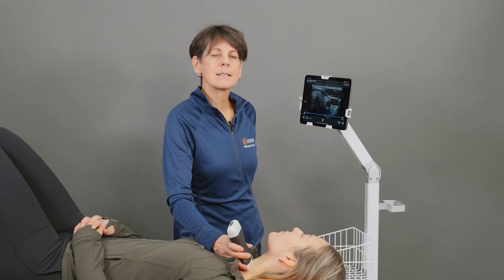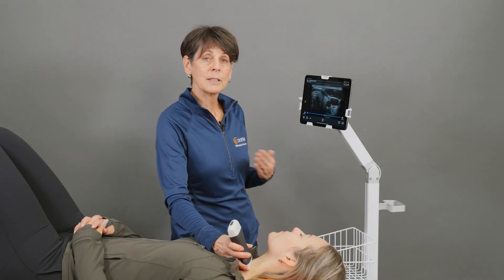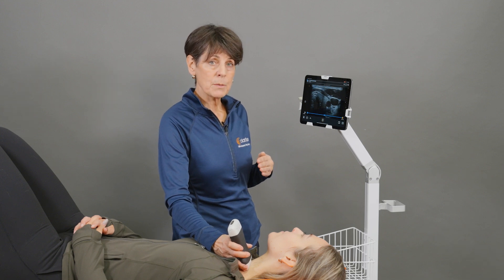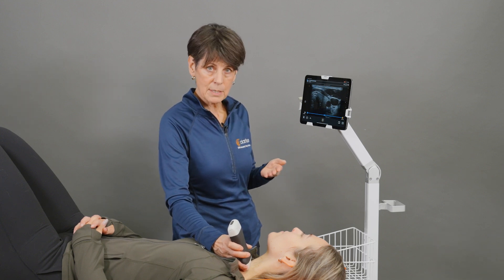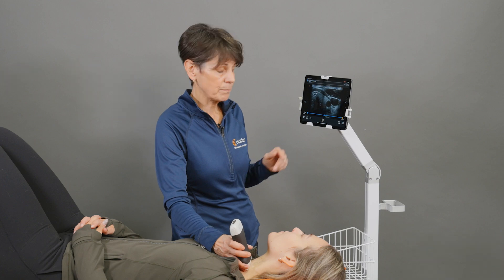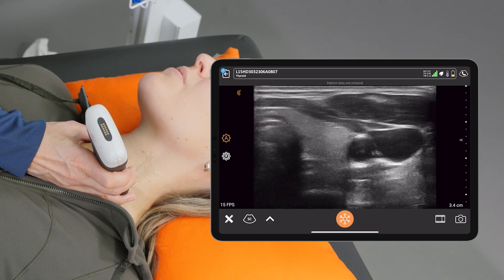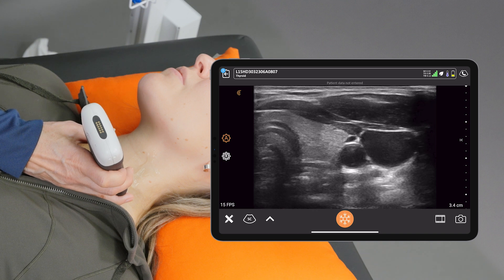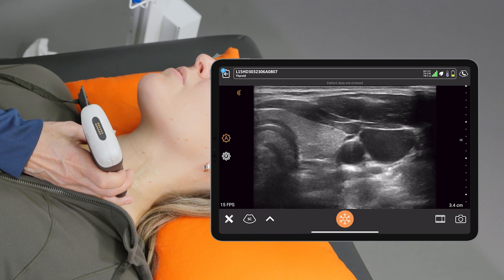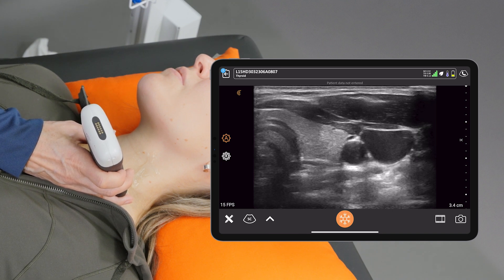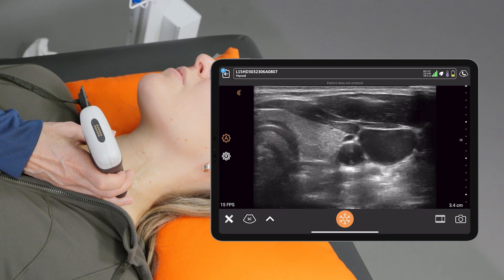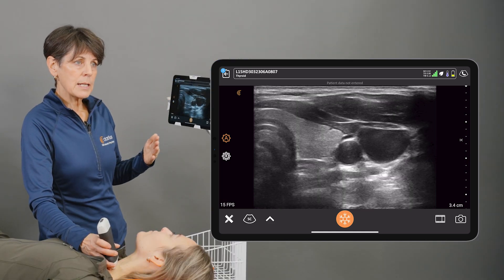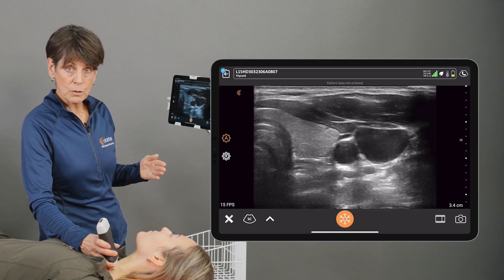Sound interacts in different tissues at different levels and so that gain may need to be adjusted depending on the strength of the signal coming back to the scanner. When looking at this ultrasound image we are seeing structures that are very dark, that are black, we're seeing bright gray, we're seeing a darker gray — those are things that you will get used to seeing and characterizing; they should look a certain way.